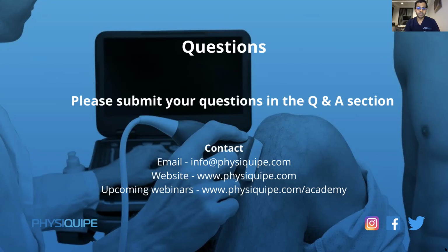If you're wondering if the glenoid labrum is torn or damaged, then ultrasound is probably not the correct imaging test. Now, you can see things like the posterior labrum when you're scanning the posterior glenohumeral joint, because you get a nice view of it, but you only get part of a view. You don't see the entire posterior labrum. So irrespective of that posterior labrum looking normal or not, you can't really comment on the rest of it. So there are some drawbacks with ultrasound when you're looking for intra-articular structures.